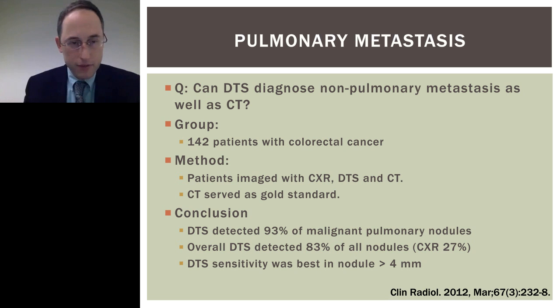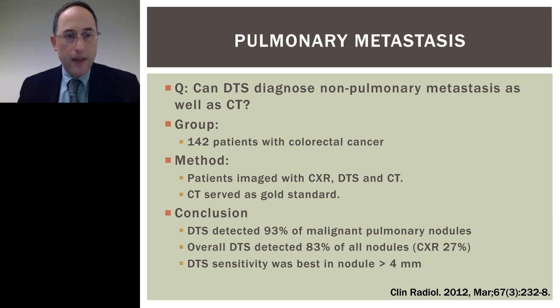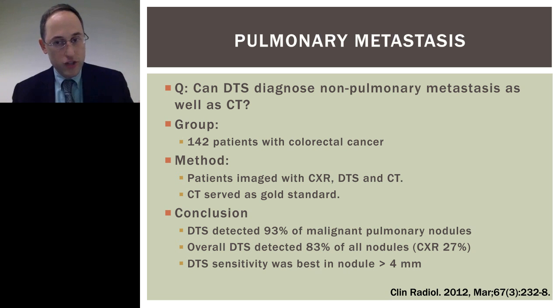So we talked a lot about nodules. Another big finding that we have in radiology, particularly chest radiology, is ground glass. Ground glass is essentially your non-solid pulmonary nodule and a lot of other things. The differential for ground glass is very large, and the problem is ground glass is very difficult to see on radiography. Patients come into the ED, they have an abnormality that is manifested as ground glass, they get a chest x-ray, you see nothing. So to illustrate that point, look at this patient on the left with the patchy ground glass. I'm going to show you a chest radiograph of that exact same patient.